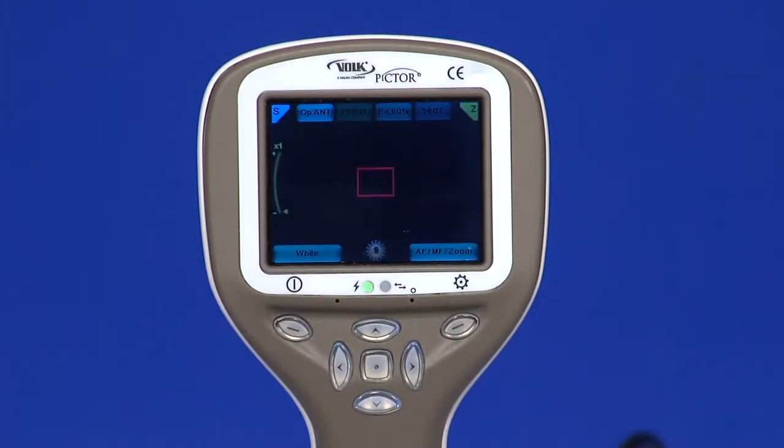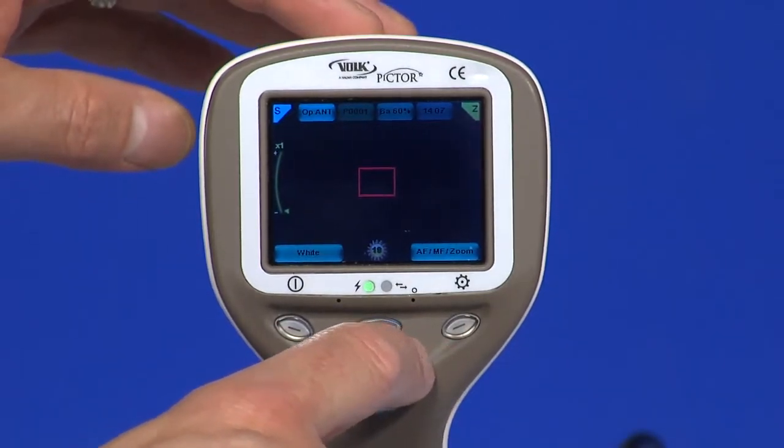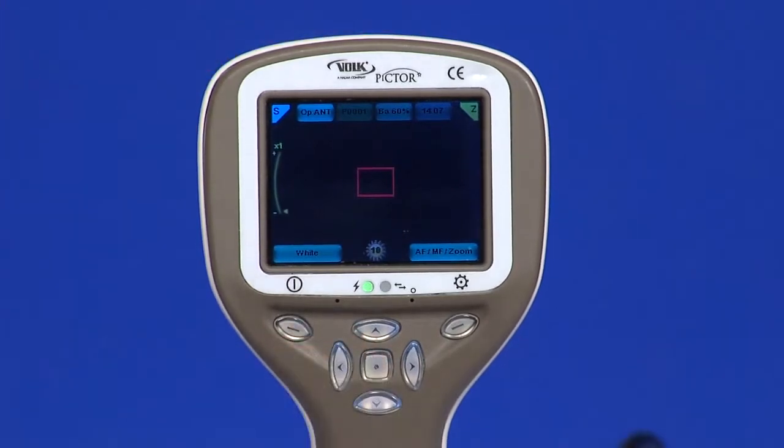Press the middle key to activate the focus window. It is possible to move it using the arrow keys to better capture the wanted area. If multiple patients are examined during the same session, it is recommended to create a new file folder for each patient's images. A new folder is created by pressing the middle key for three seconds. The icon P at the top of the screen indicates the number of the current patient folder.